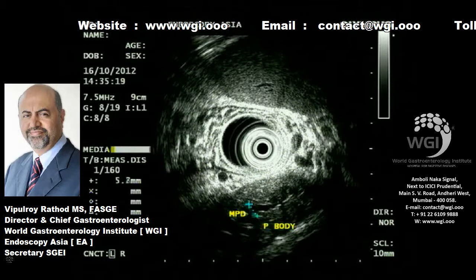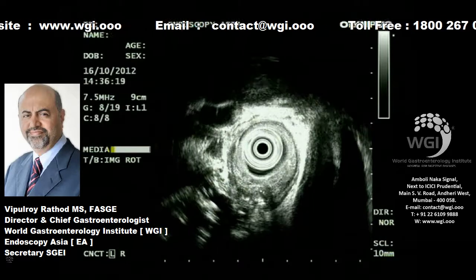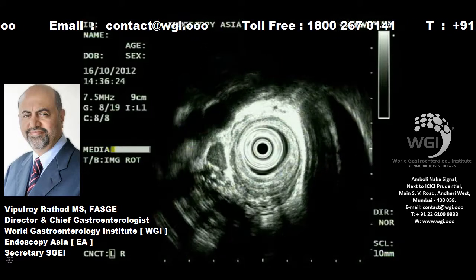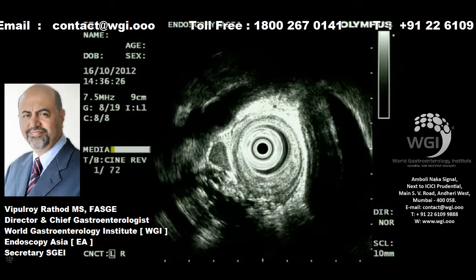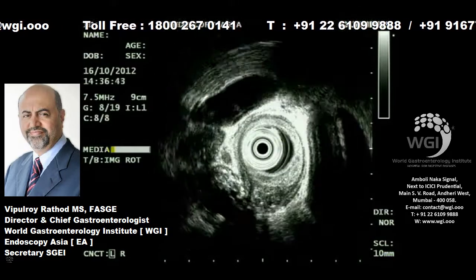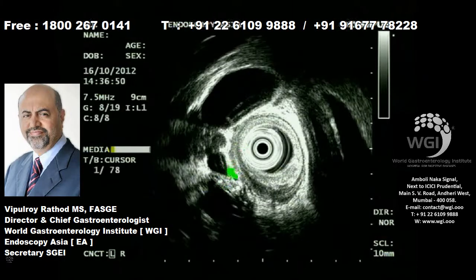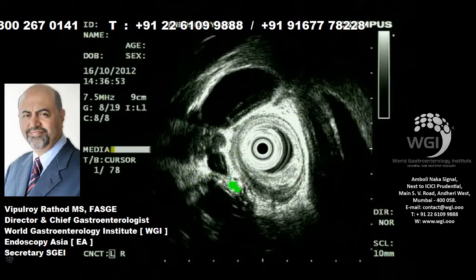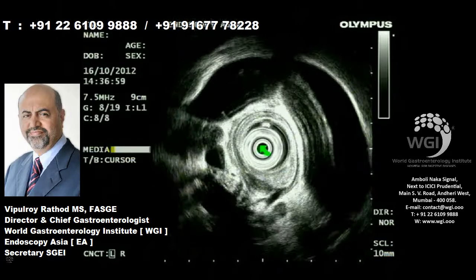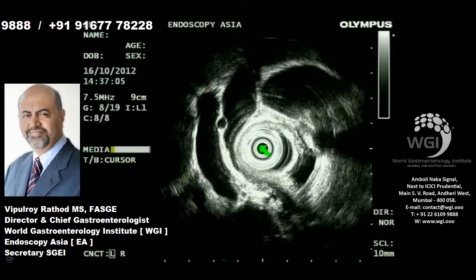Predominantly ductal disease, very little parenchymal disease, and therefore we realize that this is an advanced calculus chronic pancreatitis with inflammatory head leading to edema and the duodenal narrowing. Dilated main pancreatic duct is seen, and you can see very carefully the bile duct tapering down. Now this is the telltale sign where you see this in inflammatory head masses rather than neoplasms. Usually neoplasms will have an abrupt cutoff of the stricture.